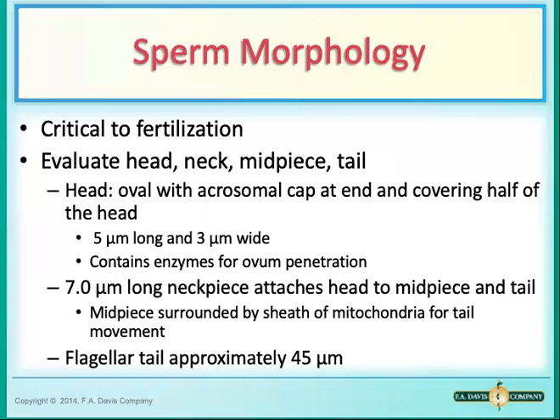Okay, now we move on to the morphology. We can't just look at the number of cells, because the morphology can also be an issue in terms of infertility. The presence of cells that are morphologically incapable of fertilization can also result in infertility.